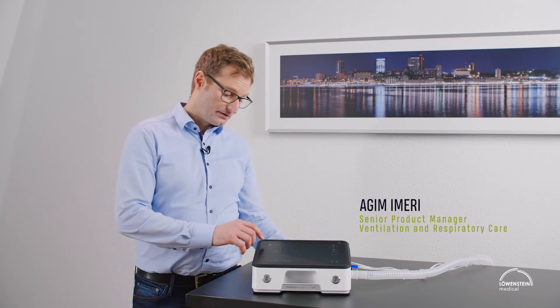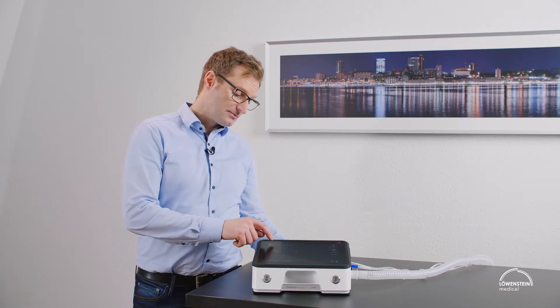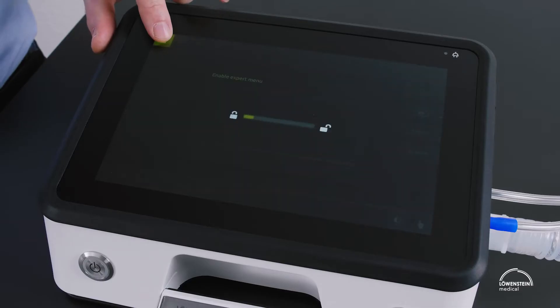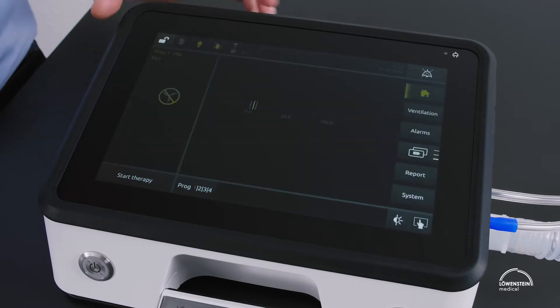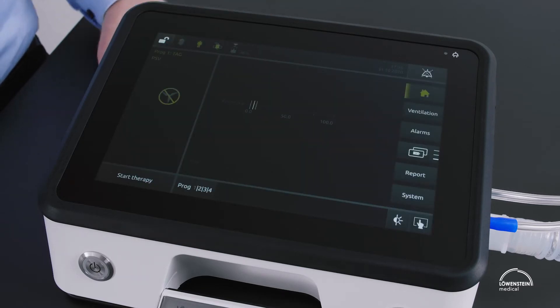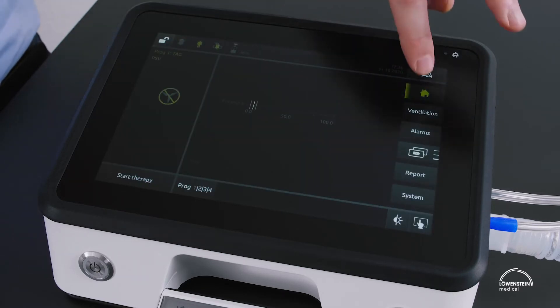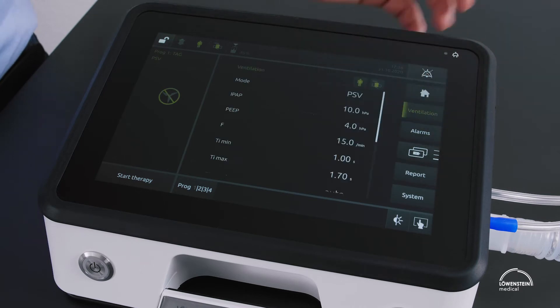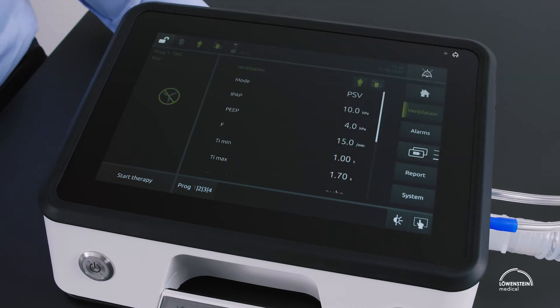To set the actual ventilation, first we need to unlock the device by pushing the key symbol for three seconds. Then we are in the expert menu, where we enter the ventilation menu.